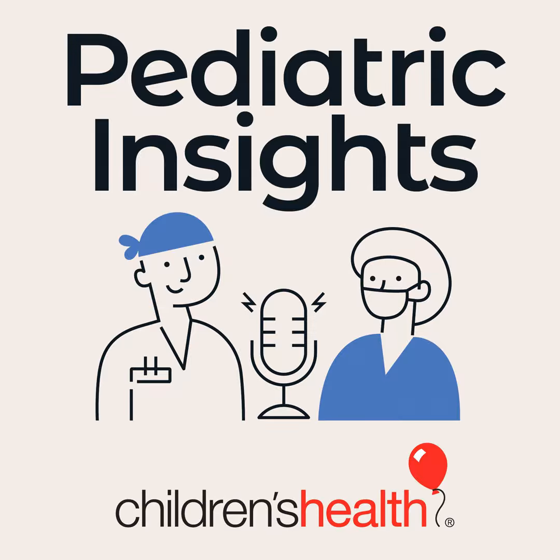We can do these sorts of surgery that we are doing robotically through small incisions in children, but you limit your visual field. And one of the key principles of surgery, no matter how you do it, is exposure. If you can't see where you're working, you run the risk of either missing something that's relevant, injuring something that you didn't see or didn't realize was close by, or not being able to really appreciate the pathology that you're trying to repair.